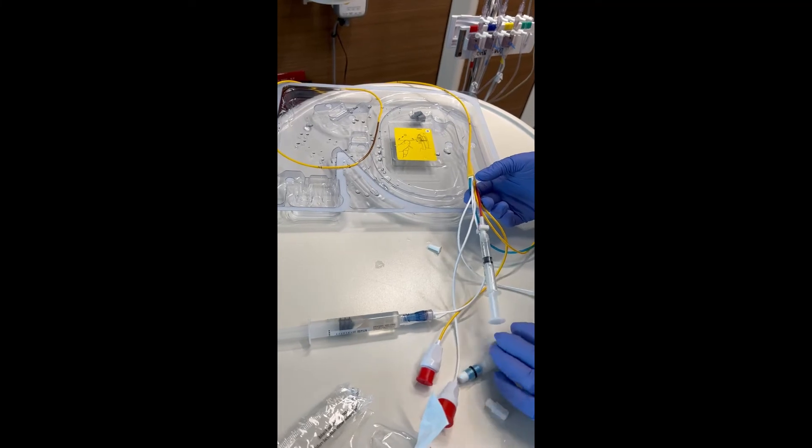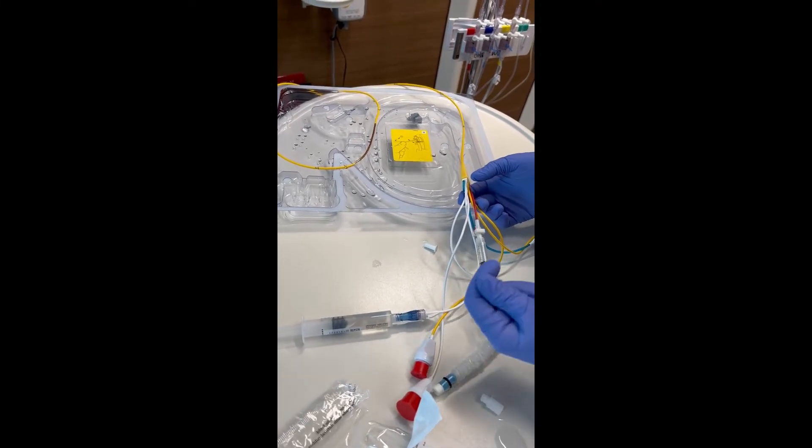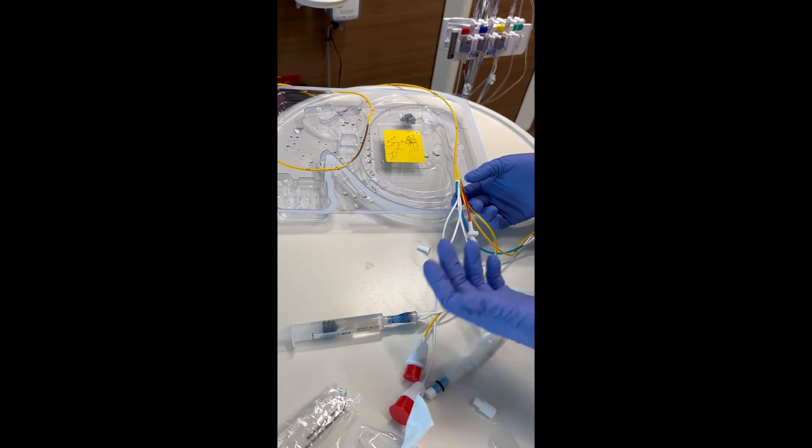Just make sure that when they ask you to inflate or deflate, after you've inflated, say balloon up. After you've deflated, say balloon down.